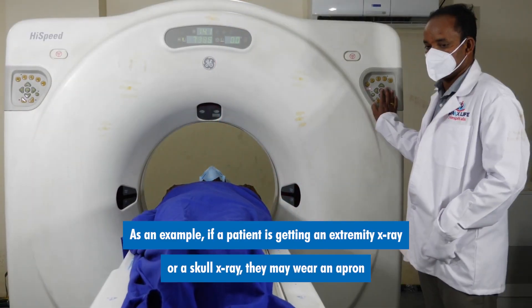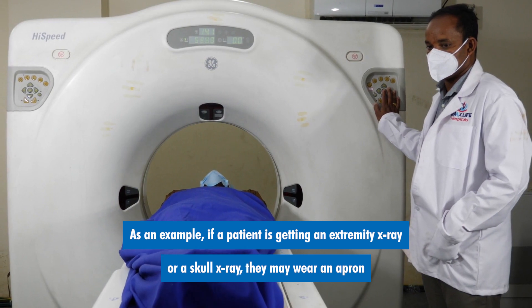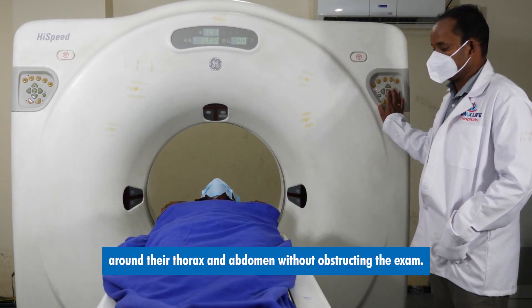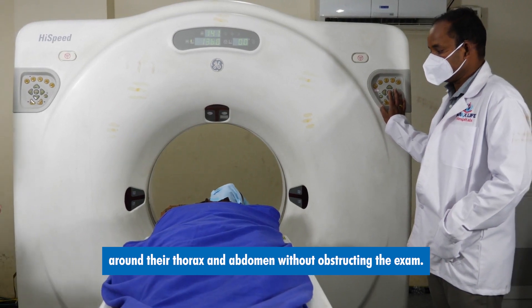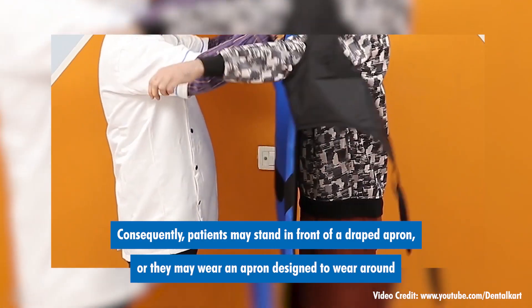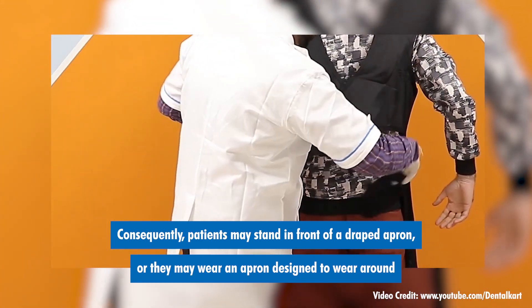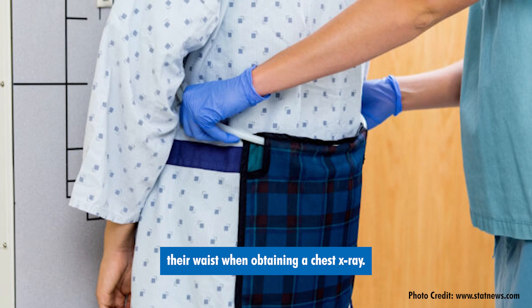As an example, if a patient is getting an extremity x-ray or a skull x-ray, they may wear an apron around their thorax and abdomen without obstructing the exam. Consequently, patients may stand in front of a draped apron or they may wear an apron designed to wear around their waist when obtaining a chest x-ray.